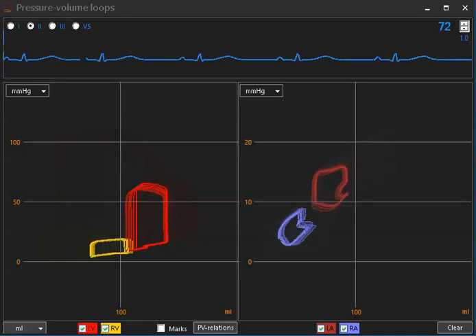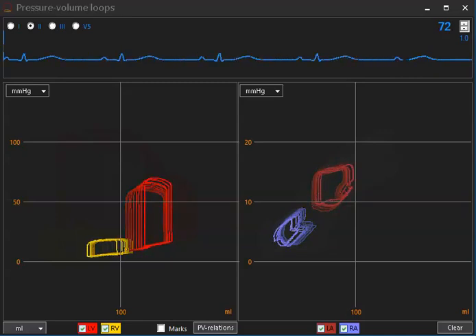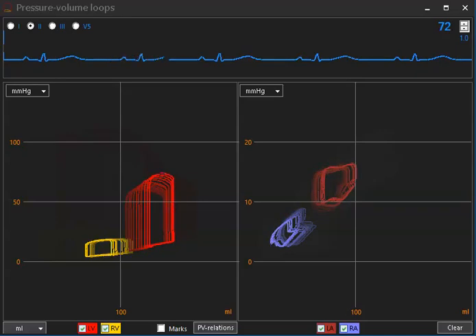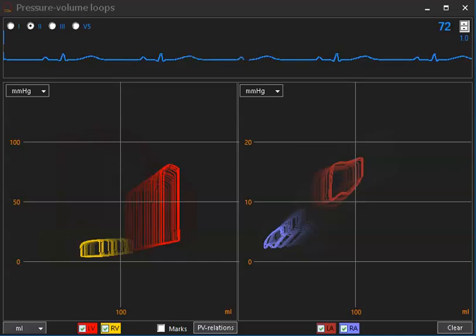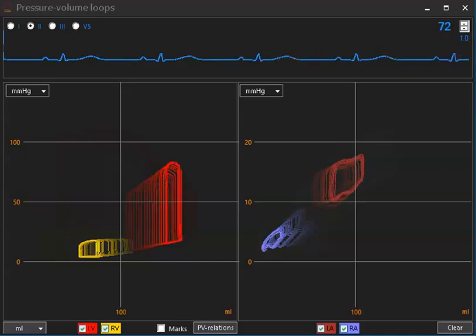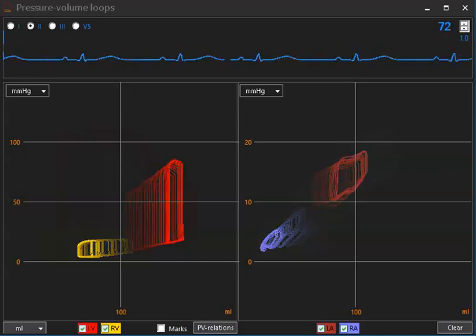Flow is now about one liter, and I'll move up to two liters, and at 3600 RPMs I'm pumping about three and a half liters.